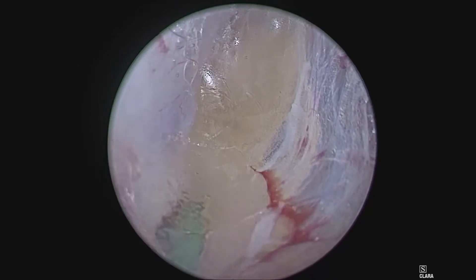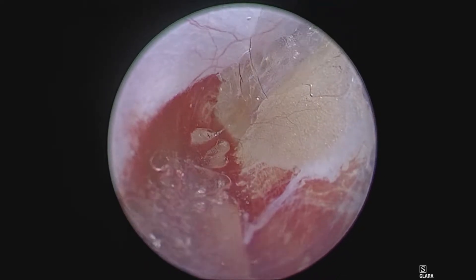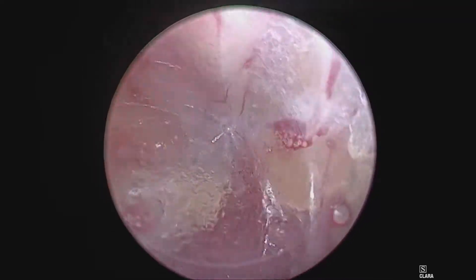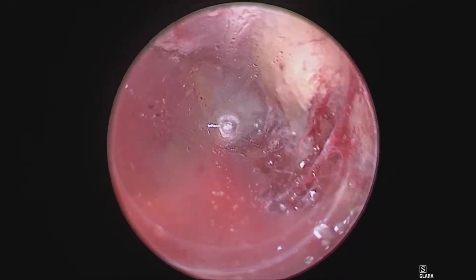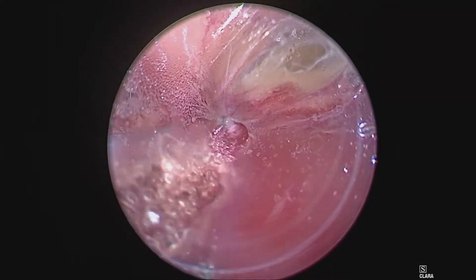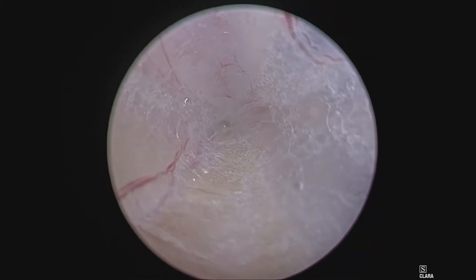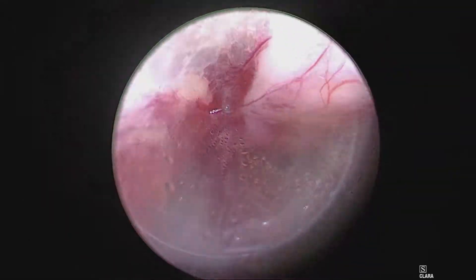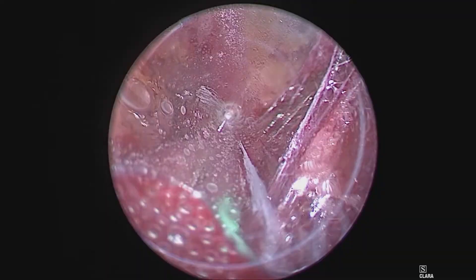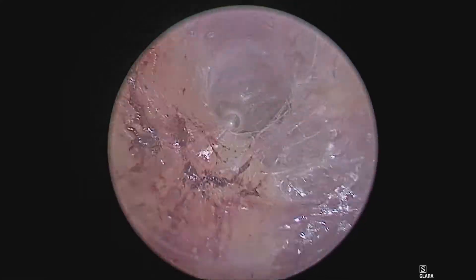I continue to cauterize while I slowly advance the blades all the way out, finishing sealing and cutting the branch as I move forward. The branch is now sealed and cut, but there is bleeding from that area. So I simply go back in and spot cauterize a small vessel that might still be bleeding. I clear off my conical tip, go back to the area and continue to spot cauterize. The branch is sealed, but I'm going to continue to dry this area up. Just lay the blades down like skis and engage the bovie. Clear off your conical tip, go back and look at that area — it's now dry.